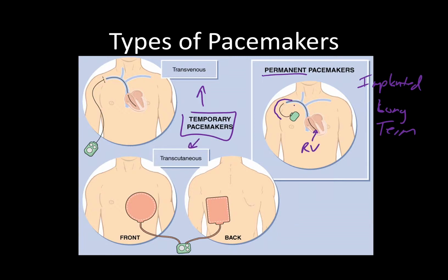The one that you've probably seen or heard the most about is going to be your transcutaneous. And this is essentially the pads. So all of these lectures prior, when I talk about the bradycardic patients and you put on the pads, that's what I'm talking about. There's actually 2 flat stickers that you put on the front and back of your patient, or however the picture on the sticker says to place it. And that's what conducts electricity.